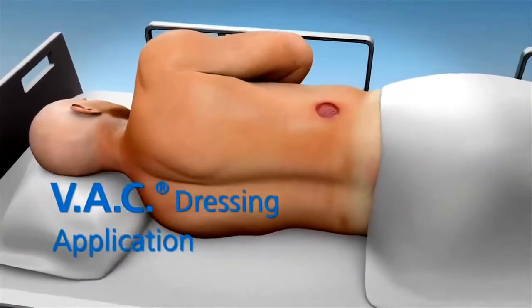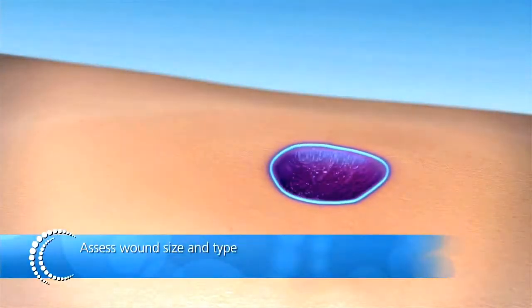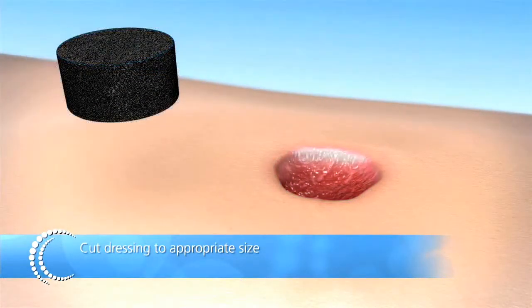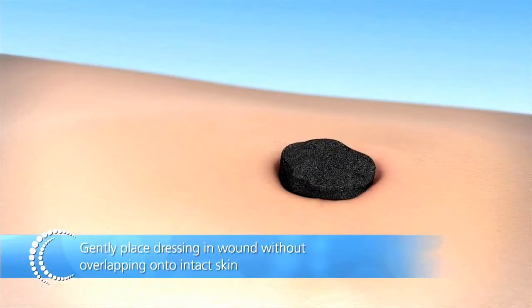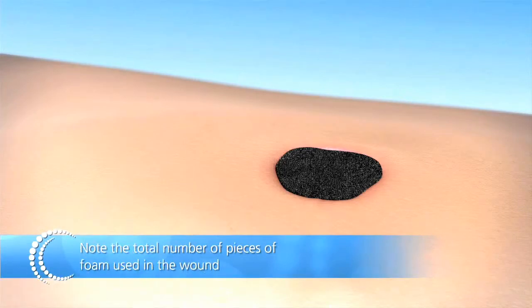VAC dressing application. Assess wound size and type. Cut dressing to appropriate size. Do not cut dressing over wound, as this could result in foam particles falling into the wound. Gently place dressing in wound without overlapping onto intact skin. Note the total number of pieces of foam used in the wound.